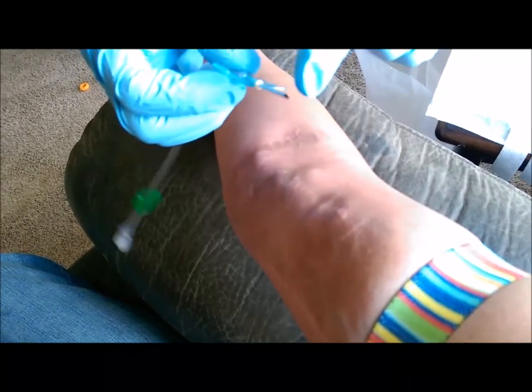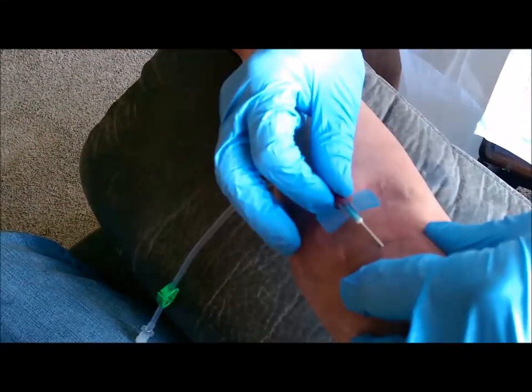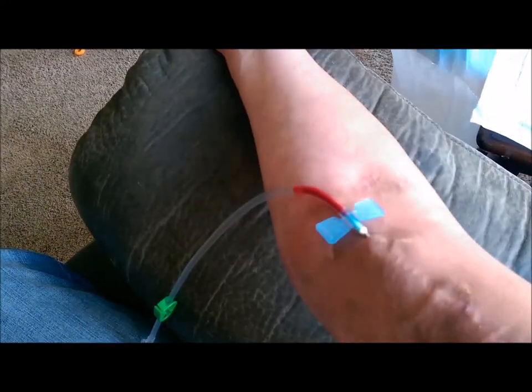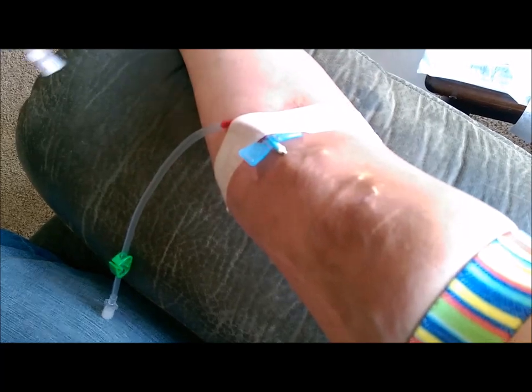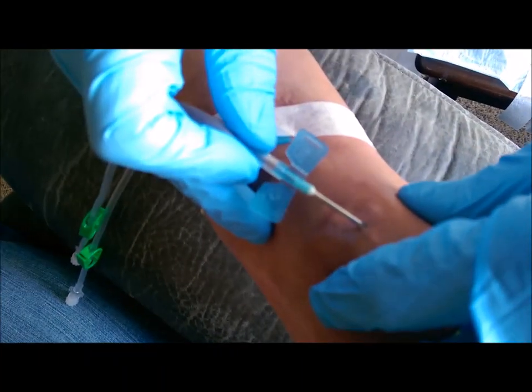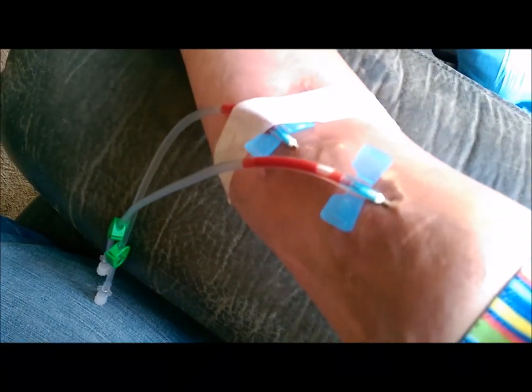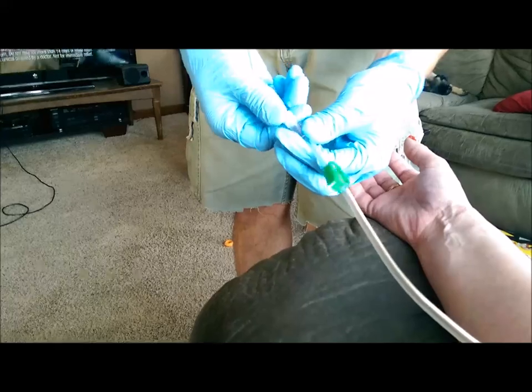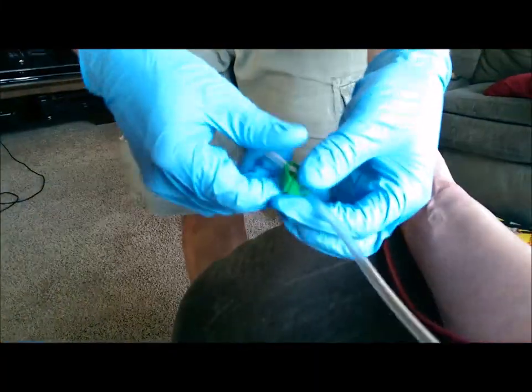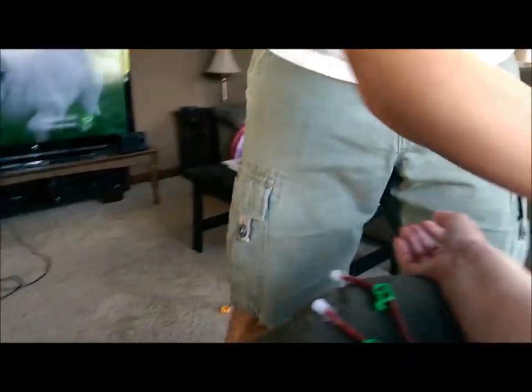Here's the needle — it's called a blunt needle because even though it looks kind of sharp, it's technically not sharp. I'm going to line it up and put it in the buttonhole. You can see the blood's starting to flow in already. I'll take a piece of tape and secure it, then do the other one. Sometimes they don't go in this well — you kind of have to fidget with it a little bit. I bleed this line, blow it all the way to the end, clamp it off. Same thing with the other one — bleed it, clamp it. Then turn off the tourniquet so her arm doesn't blow up. Tape everything up nice and good so the needles don't fall out.